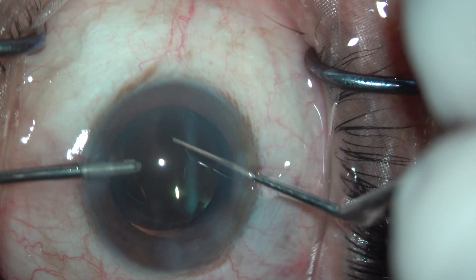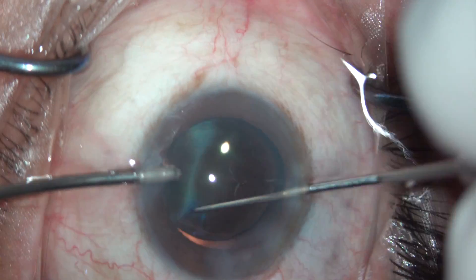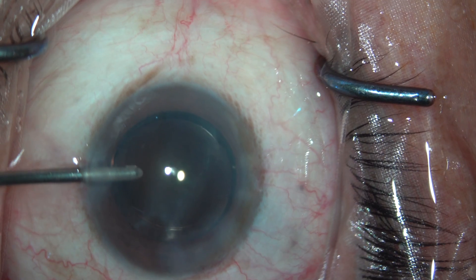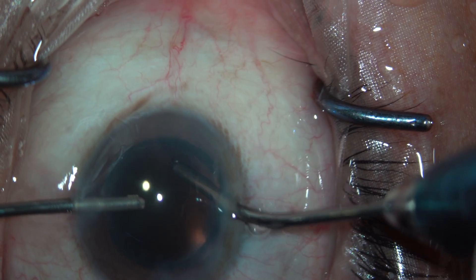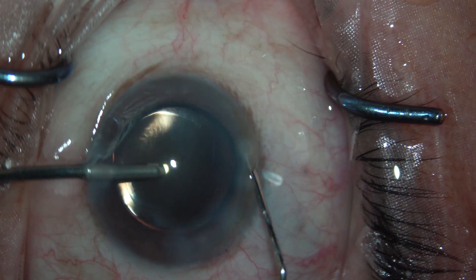Rotating it into the back — my technique for implanting IOLs is always hydro implantation because I don't need to go behind the IOL to watch the viscoelastic behind it. So except for a three-piece lens, in all cases I prefer hydro implantation. It makes the surgery quicker, faster, and unnecessary steps are avoided.